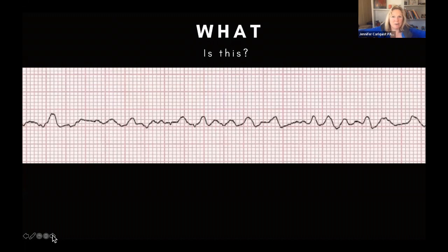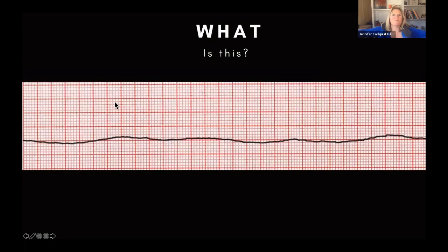All right, now let's give you another one. Okay, ready, set, go. Which one is this one? What arrhythmia is this? If you saw this, would you be worried? Yes, Karen on Facebook is also answering. Okay, Megan says asystole or fine Vfib. Melissa says asystole. Okay, yeah, this one was kind of a tough one. Anne says asystole, good. Everybody says a flat line, asystole.